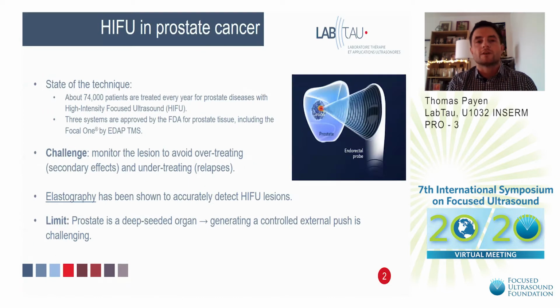So first, a few words about HIFU in prostate cancer. HIFU treats 74,000 patients every year for prostate diseases, and it's done with three systems mainly that have been approved by the FDA, including the Focal One that is used in this study.